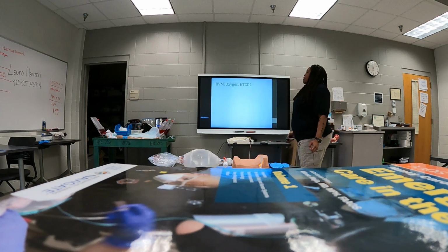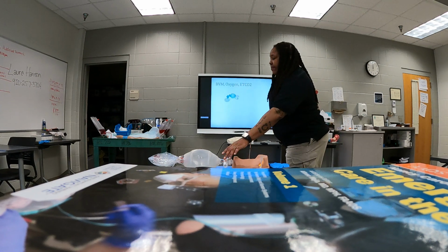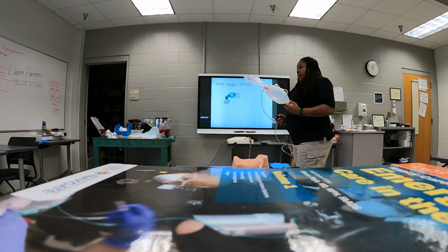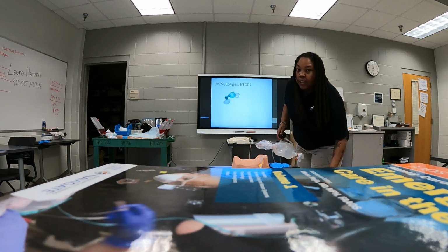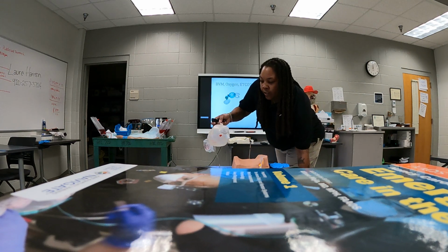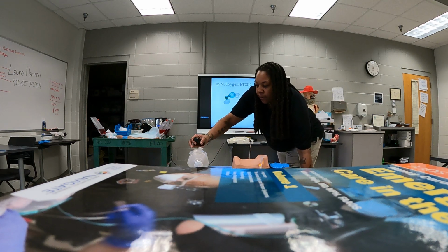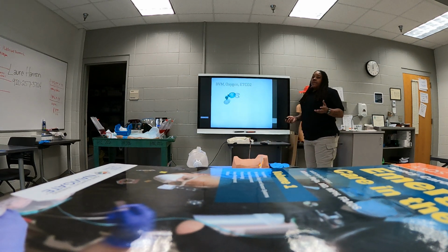You also need your BVM, your oxygen, and your end tidal. If you don't have your BVM, then you're doing all this for nothing. If you definitely don't have oxygen, then you're definitely doing all this for nothing. However, your end tidal, the reason why that's important is because it's going to help you measure placement, as well as it's going to help you measure if they're getting ventilations effectively, all right?